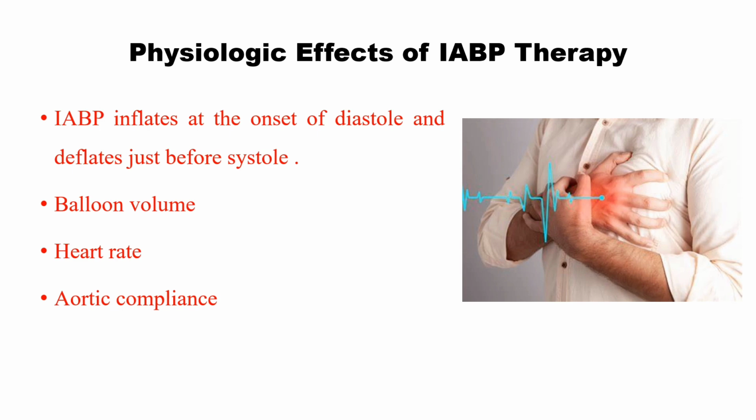We'll see the physiological effects of IABP therapy. The intra-aortic balloon pump inflates at the onset of diastole and deflates just before systole. The magnitude of these effects depends upon the balloon volume, heart rate, and aortic compliance.